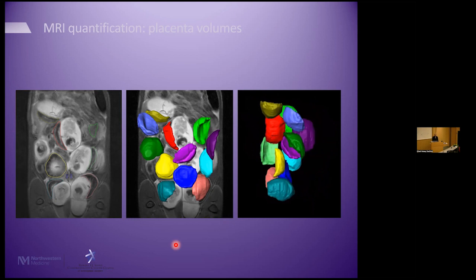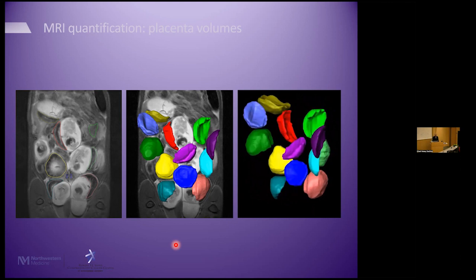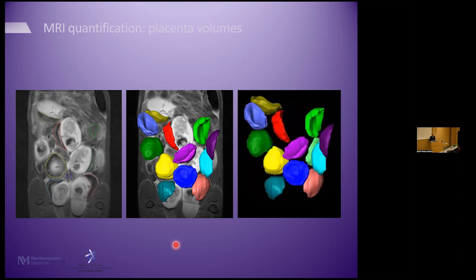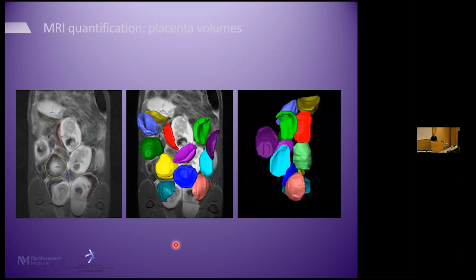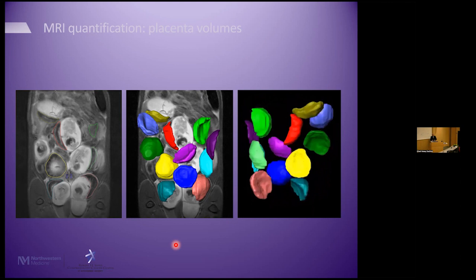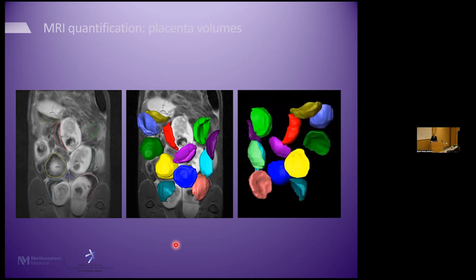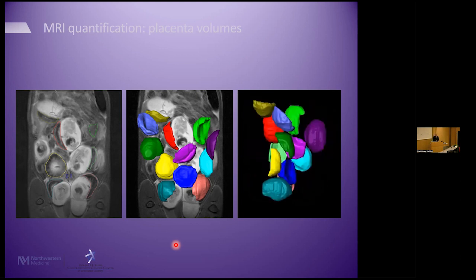I should say, as a side note, for tumor imaging or just tumor research in general, volume is a bad measurement. With MRI, you could see, for example, that the tumor gets bigger, but the interior is necrotic or disrupted. So just because the volume got bigger, does that mean it failed? Probably not. You could also see examples where the tumor volume shrinks, but the vasculature hasn't changed. So did it work or not? It's hard to say. So if the only thing you take home from today outside of the alphabet soup is: tumor volume measurements are bad, especially if you have MRI available.